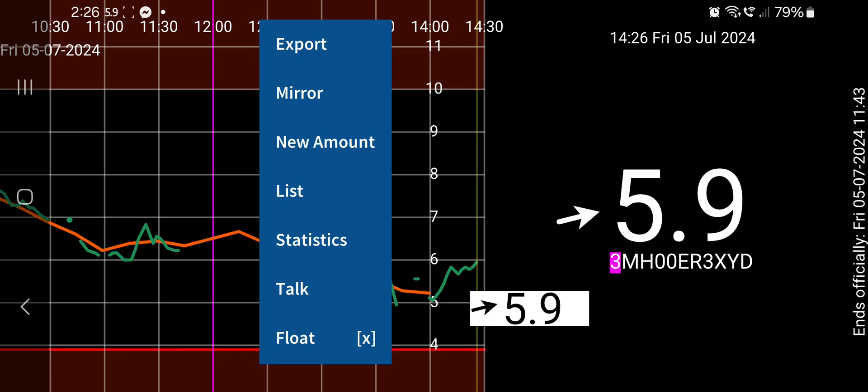And there's a few settings, but the main settings I liked was the Talk setting. And here you see Float, which is really handy. So you see a little 5.9 value floating there with a little arrow on it.